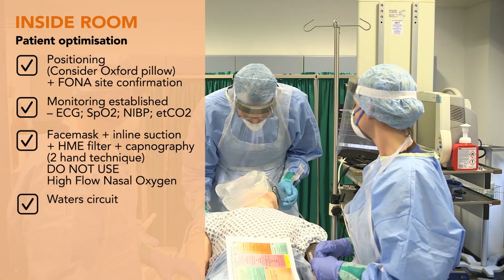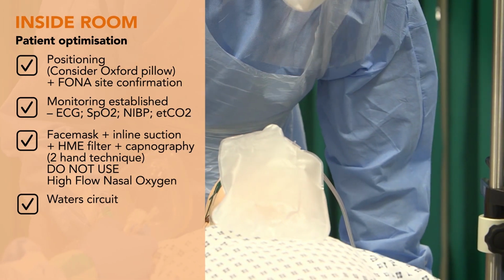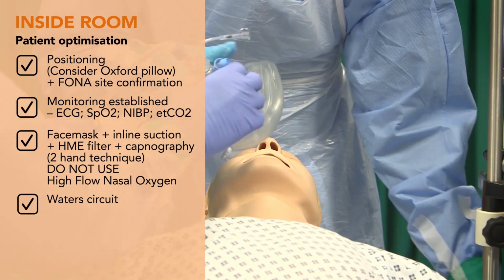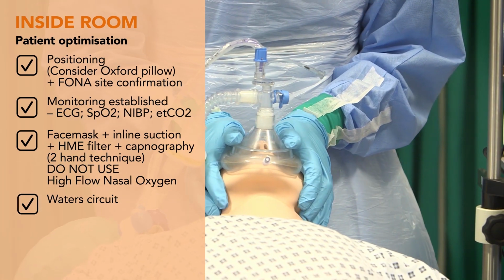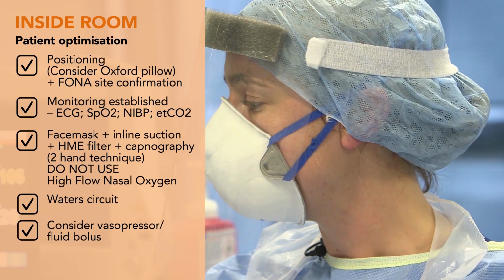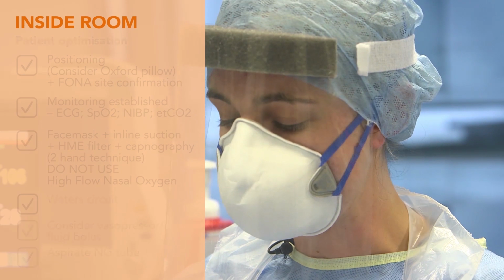I'm just going to switch this mask over now, sir. So I'm going to turn off the oxygen to the non-rebreathe mask just to minimise aerosolisation and replace it with the face mask, which I'm going to secure with 2 hands. So we're going to consider a vasopressor and fluid bolus if needed, and aspirate an NG tube if there is one. So now we're going to go on to our pre-intubation check.